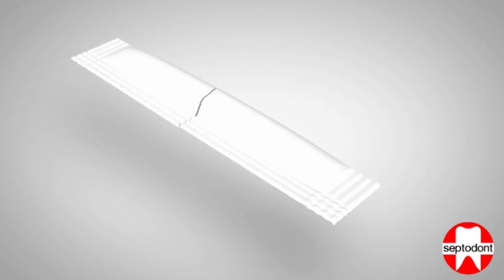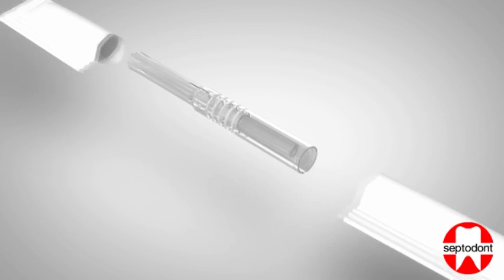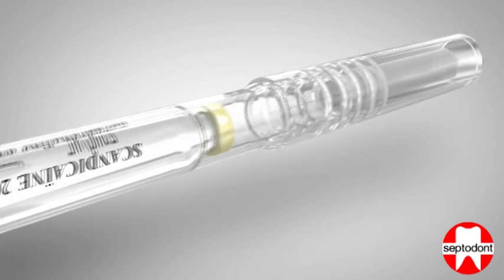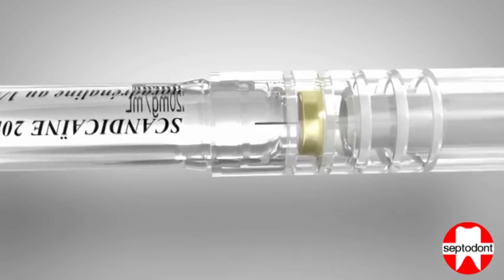Remove the syringe by tearing its protective wrapping. Step 1: Grip the barrel firmly and fully insert the cartridge into the open barrel end of the syringe.